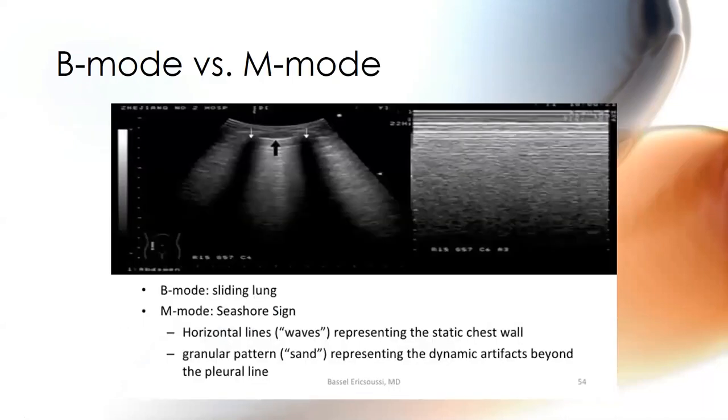All right. More review. We talked about B mode versus M mode. So B mode, brightness, that's going to show you, let's look again, rib shadow, pleural line, wonderful. Do I have sliding lung? Can you see sliding lung on this image that doesn't move? What do you think? Yes, because I said, in a static image, now you don't know where I'm shooting the line because this hasn't activated yet, but you would see a line straight down here, straight. And it tells you over time. So one image of M mode will show that you're demonstrating motion.